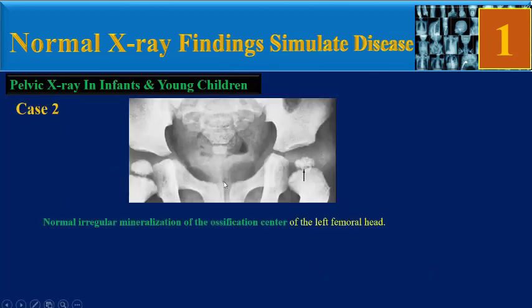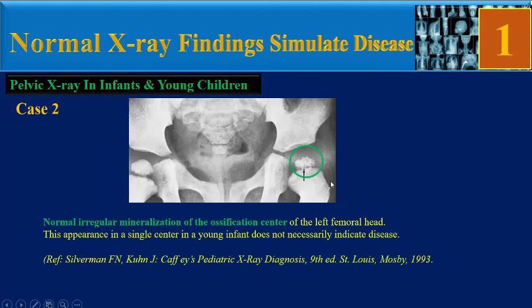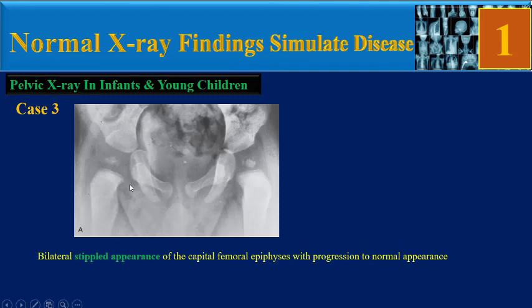Case 2: normal irregular mineralization of the ossification center of the left femoral head. This appearance in a single center in a young infant does not necessarily indicate disease.